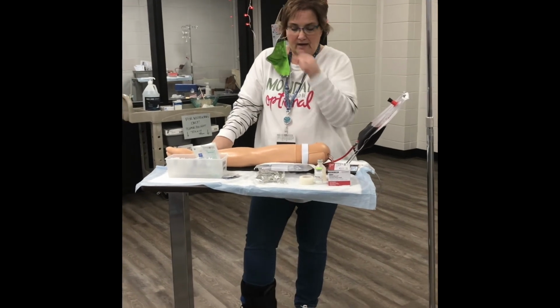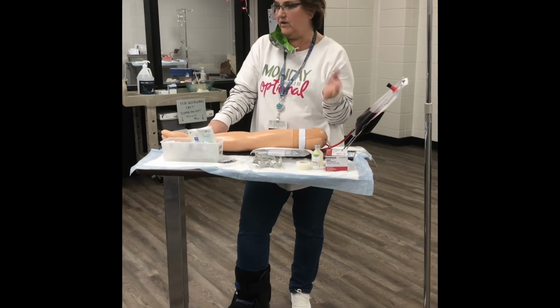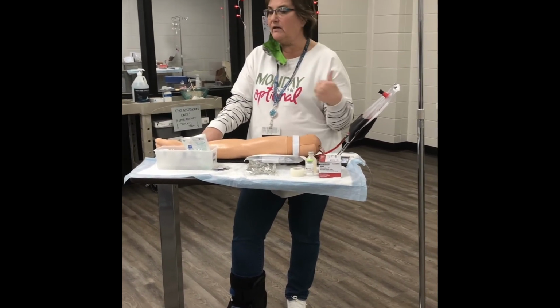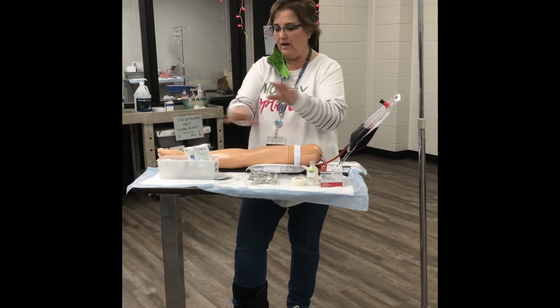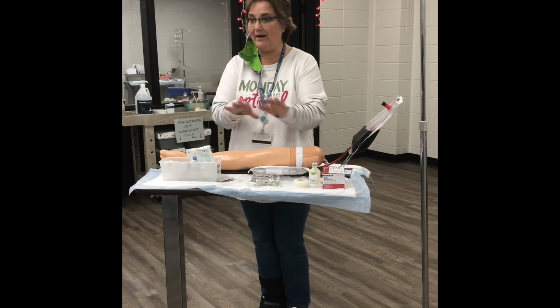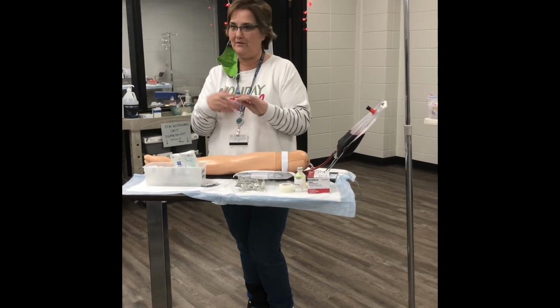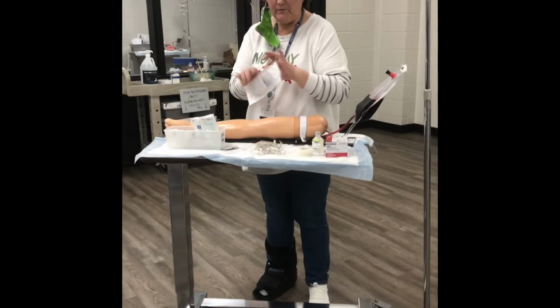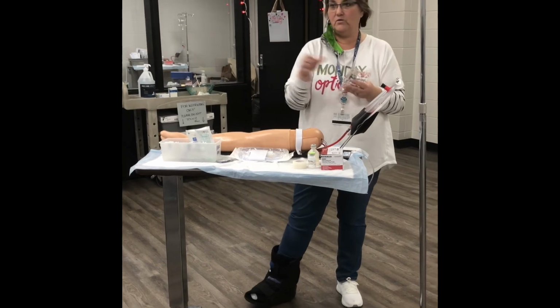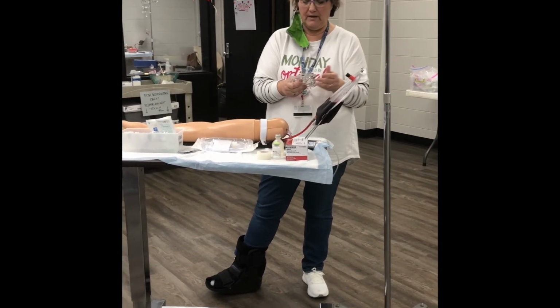So once you've done that, you compare your orders to your MAR. Then you can just use your MAR just like you did in the other thing. We're going to get everything ready before we go in our patient's room, but you are not going anywhere but here. All right, right here, right now, we're pretending it's the med room, and in a minute it'll be the patient's room. So we're going to make sure we have the correct fluid that's ordered. Obviously, it won't have our patient's name on it that we can check, but you want to make sure I have normal saline.